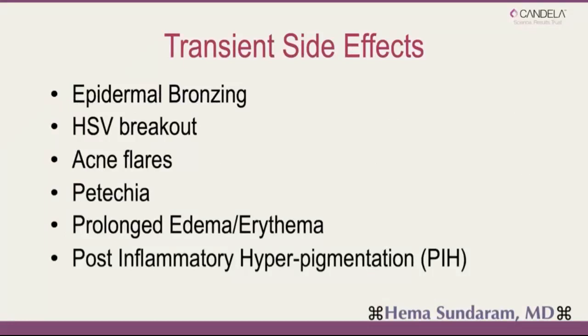As far as prolonged edema and erythema go and post-inflammatory hyperpigmentation, this is one thing where I've been very, very pleased with my CO2 laser. Because I really find that I'm not sitting there worrying about these side effects, providing I use the appropriate parameters and the appropriate technique. I've never actually had a problem with this.